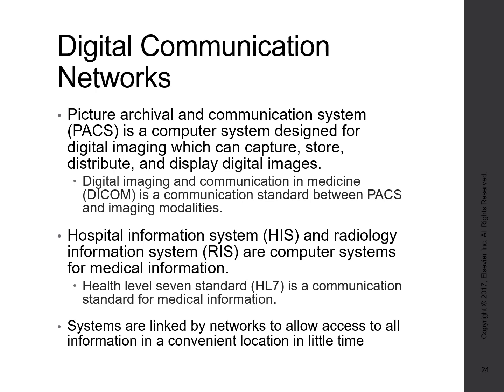So what DICOM is, Digital Imaging and Communications in Medicine. And this was developed back in the 90s when they realized that, hey, this digital imaging thing is taking off. We need to do something. So they developed a very specific set of rules for all digital imaging so that when you take an image at a particular institution, and you send that image over to another institution, that institution is able to handle the data.